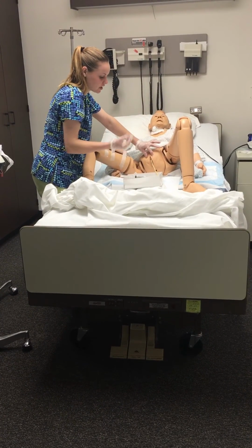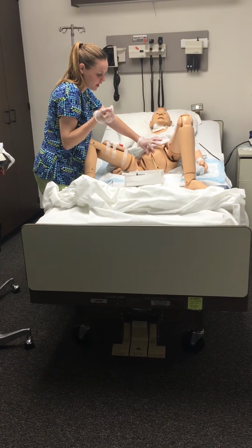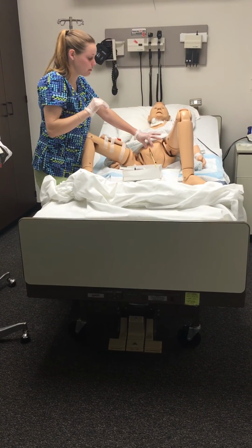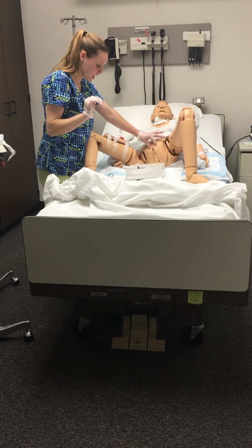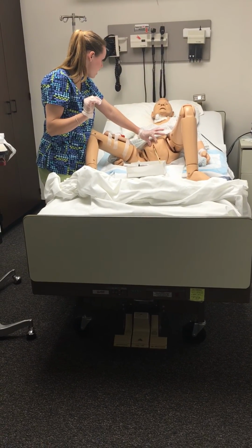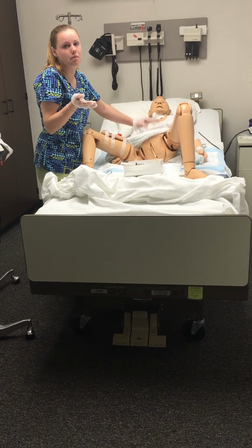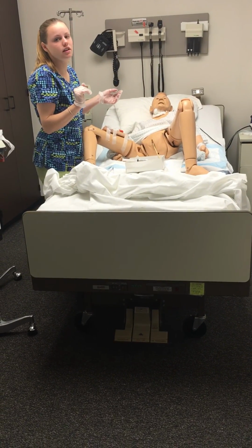And then I would attach the catheter to the patient, and I would hang it on the side of the bed, making sure it didn't touch the ground, but it was below the level of the patient's bladder. And at that point, I would ask if the patient was comfortable and there's anything else they need. And then I would do my peri-care, remove my gloves, and this skill would be complete.